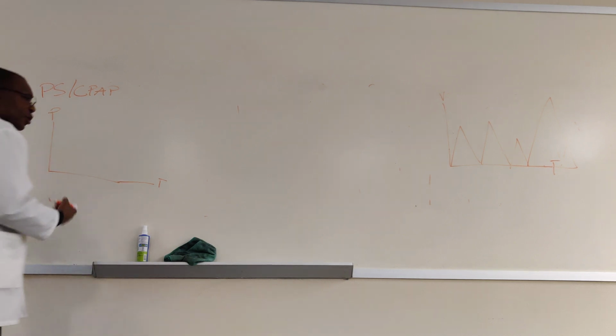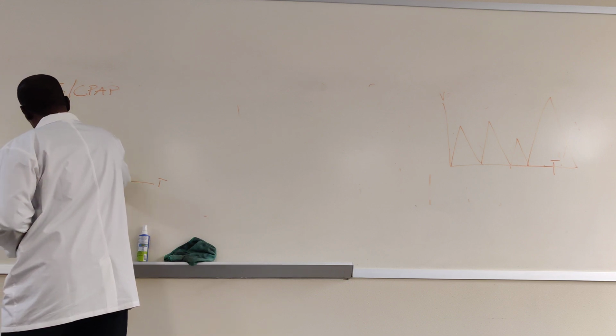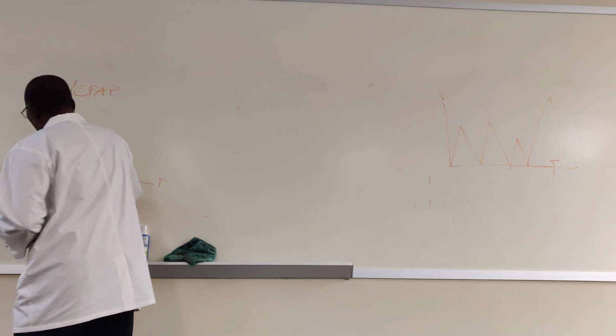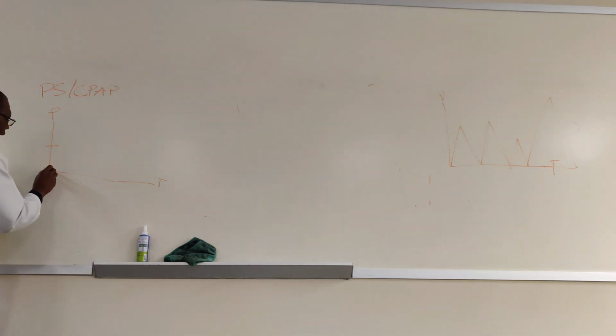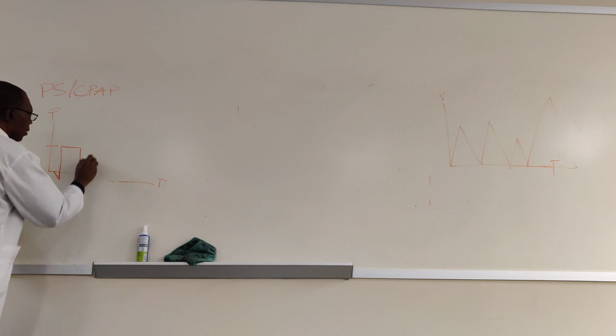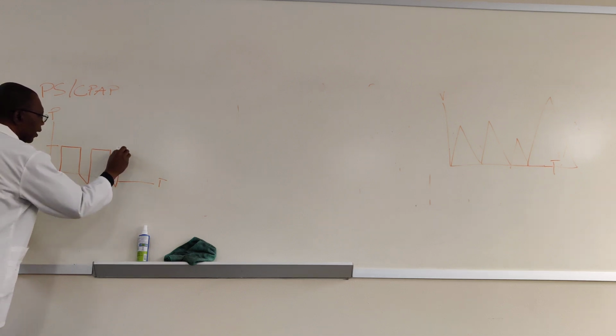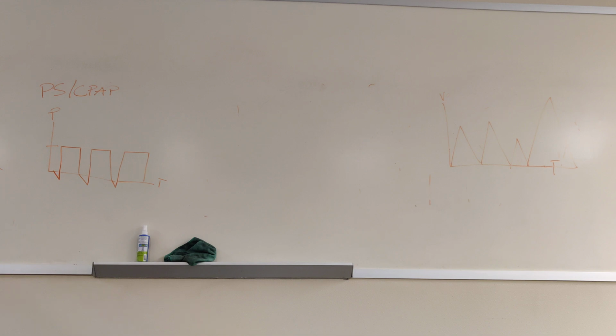So the pressure goes to the airway and holds the airway open. So you're always going to have the step pressure rising there. But it's a spontaneous mode, so every one of them is going to have that indentation like that. The patient is triggering all the breaths, like that. Okay?